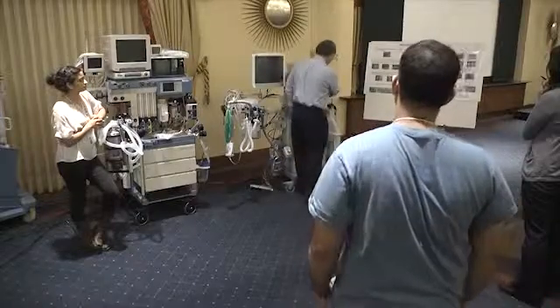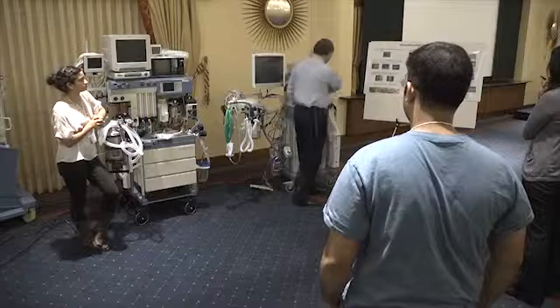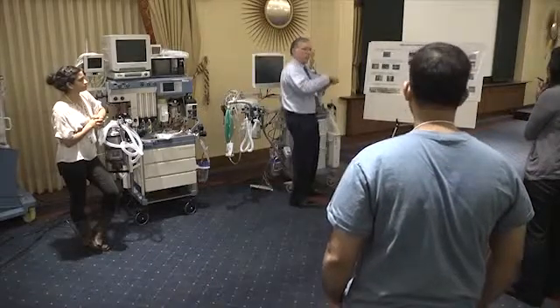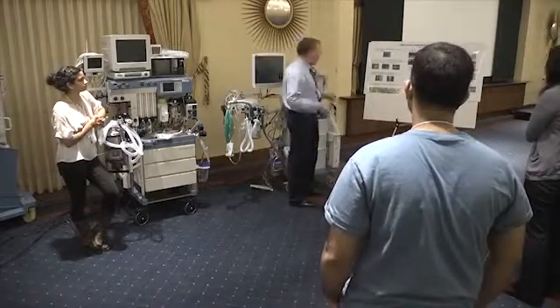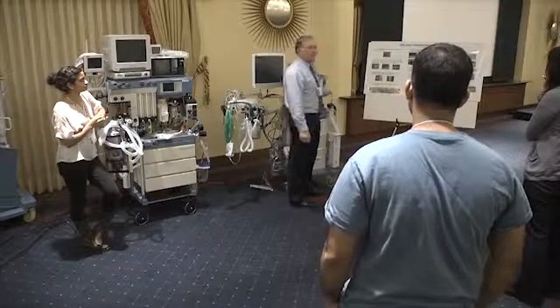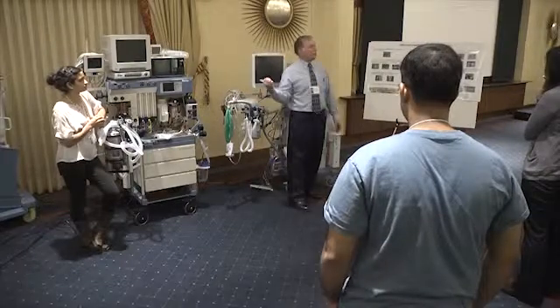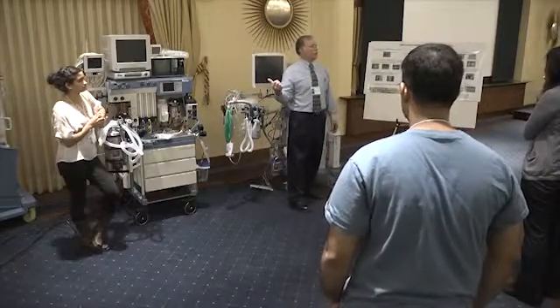And these are the input and output ports right here, these two posts that are sticking up, and there's a little cylinder in the middle that actually compresses down, that lets the vapor out. You also can see these little white rings around the outside. These are O-rings. If these are missing, or if these are compromised, or if these posts are, your vaporizer is going to leak. Okay, there's just no way around that.